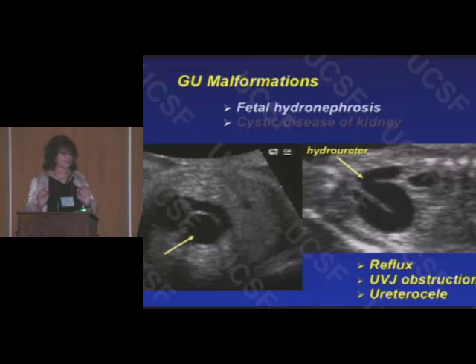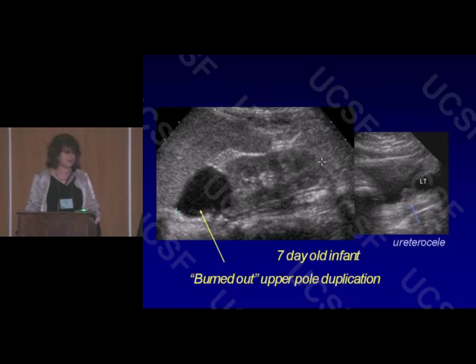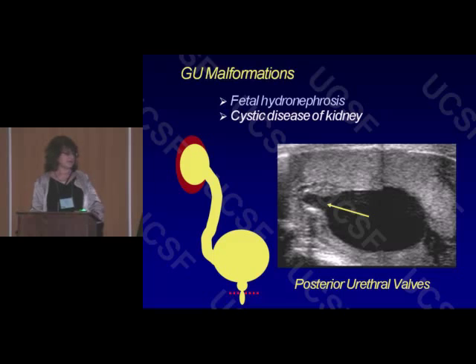Ureteroceles deserve kind of special attention. You need to image the fetal bladder at the right time so that there's fluid in the lumen surrounding the fluid-filled balloon of a ureterocele. If a ureterocele is seen, remember that's often associated with a duplicated renal collecting system. This is postnatal evaluation of a fetus who had been seen in utero. You'll see this entity again later in the week when the pediatric section presents the upper pole dilated and the associated ureterocele in a case of duplicated renal collecting system.